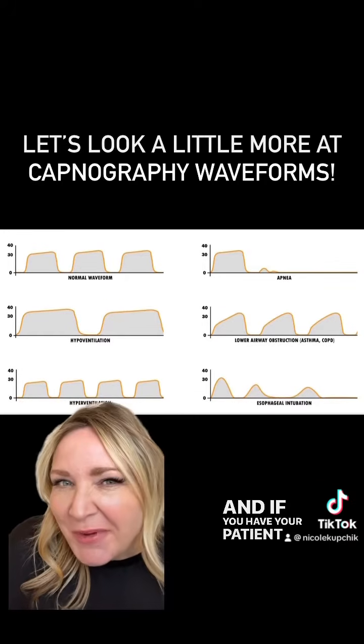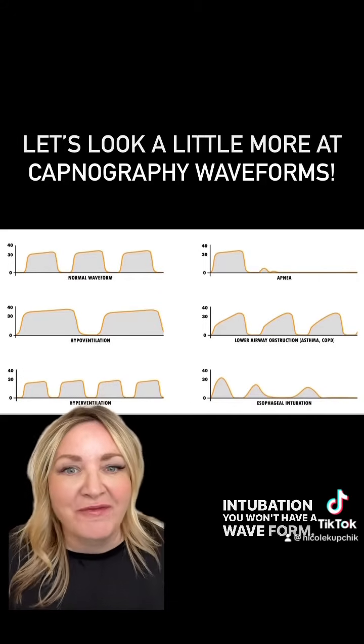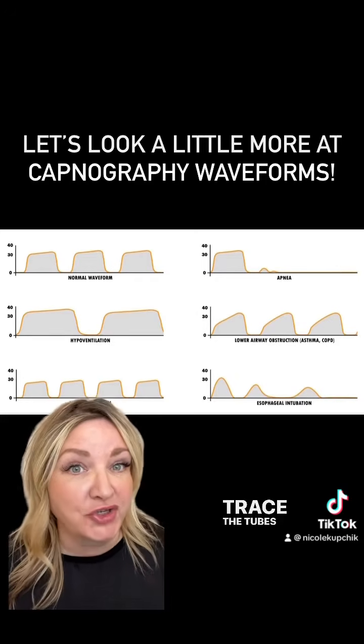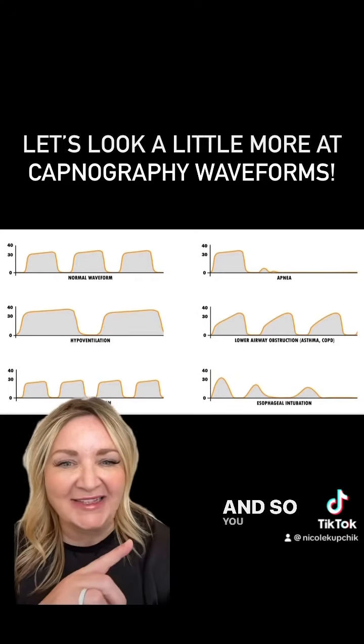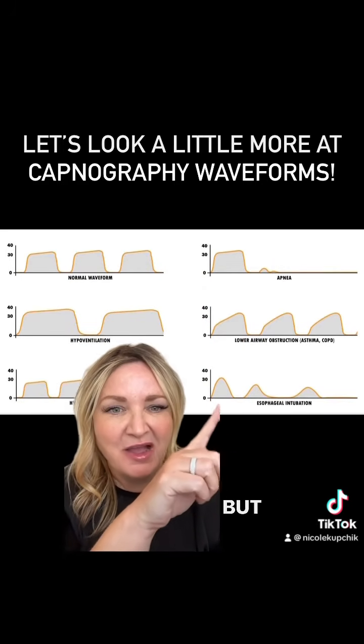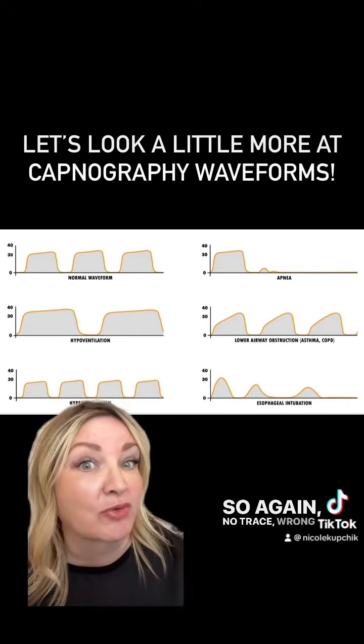And if your patient has experienced an esophageal intubation, you won't have a waveform. And so the little rhyme I always use is: if you have no trace, the tube's in the wrong place. And so you can see here, this is actually indicating apnea, but you could see a very poor waveform there. So again, no trace, wrong place.